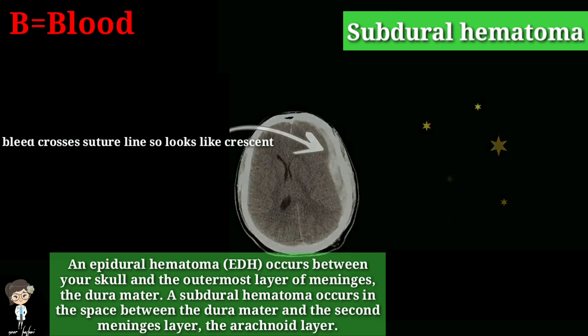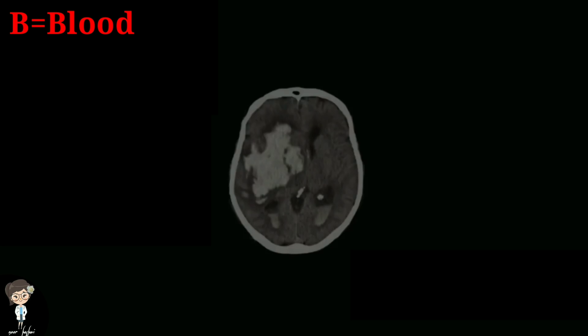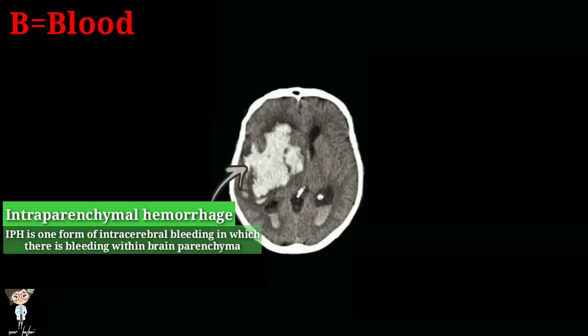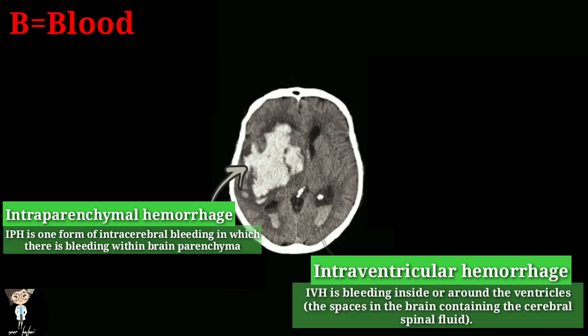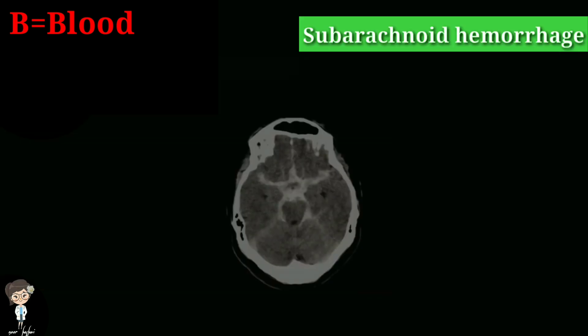Now we will see intraparenchymal and intraventricular hemorrhages. Intraparenchymal hemorrhage, as the name indicates, is bleeding in brain parenchyma, while intraventricular hemorrhage is bleeding around ventricles, which is the space in the brain containing cerebrospinal fluid. The most common cause of intraparenchymal hemorrhage is hypertension, while primary intraventricular hemorrhage is rare, but causes include intraventricular tumors and aneurysms.